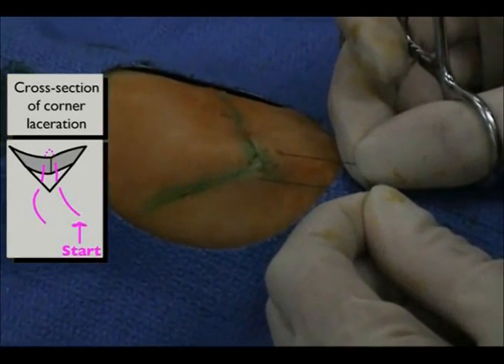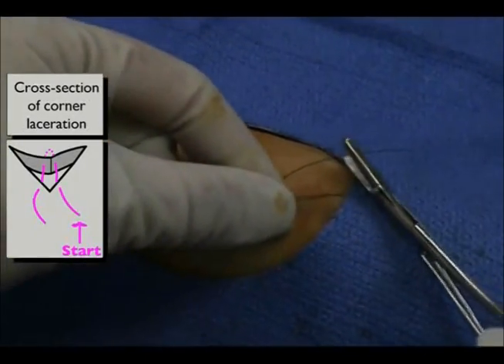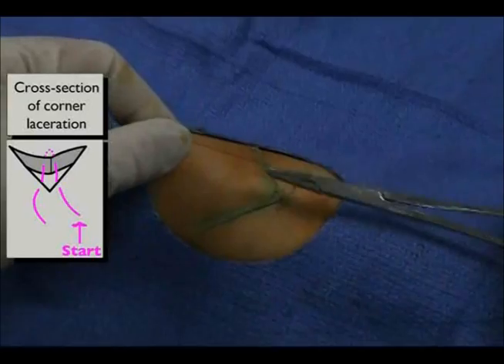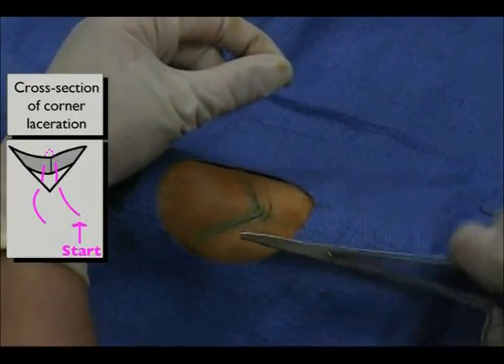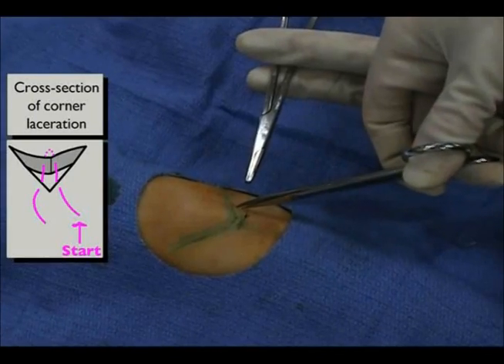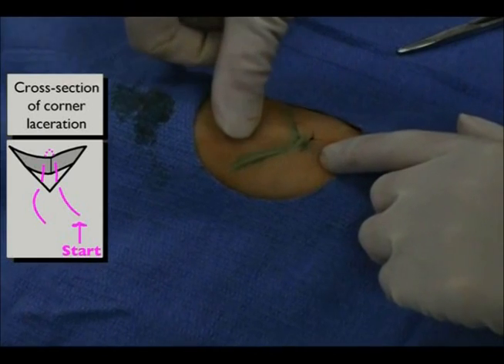Pull the two ends of the suture taut to check if the corner suture adequately approximates the wound edges. If so, tie a knot as described in the simple interrupted suture section. Finally, cut the suture.